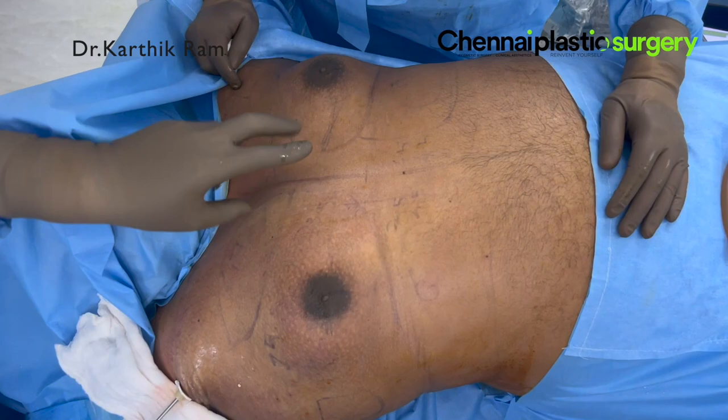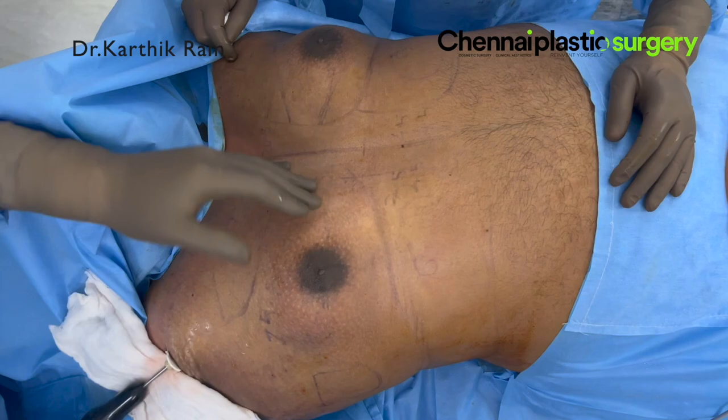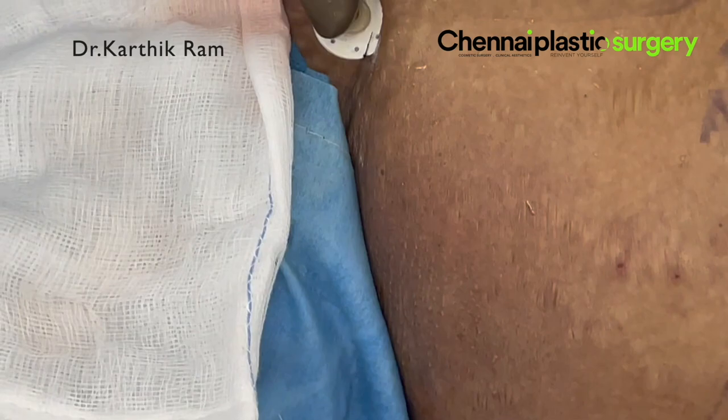The medial side has to be considered as a pedicle, because in a very long gynecomastia, that medial area — you should not do superficial VASER because we want the blood vessels to remain intact. Not only VASER, but even liposuction should not be done in the pedicle area. We consider it as a superomedial pedicle. We keep that blood supply intact in those areas.